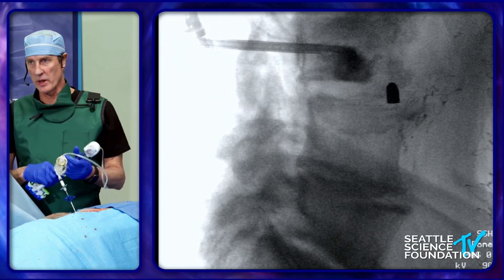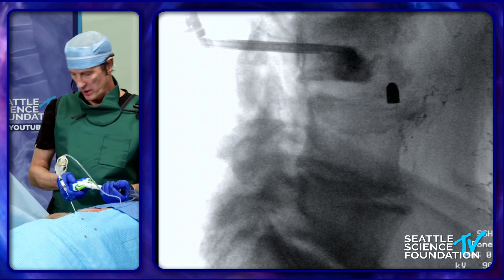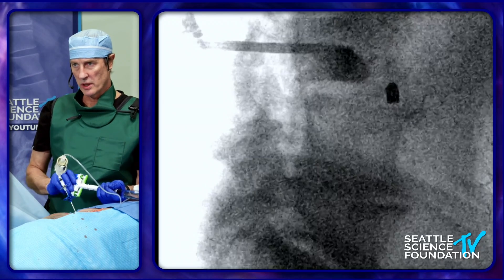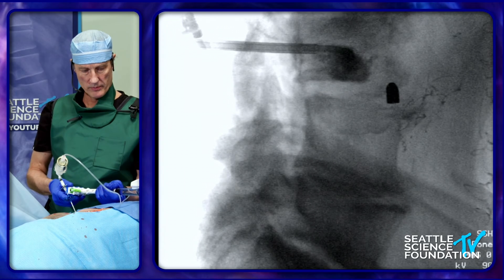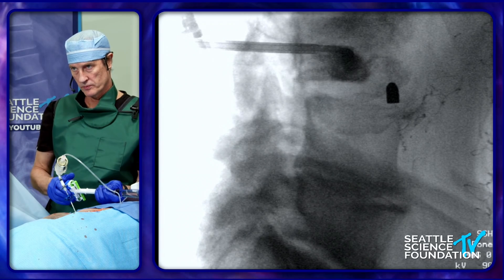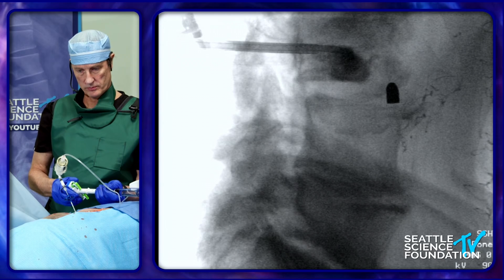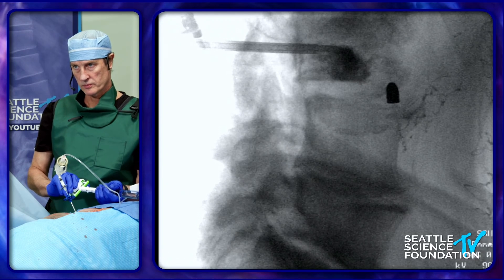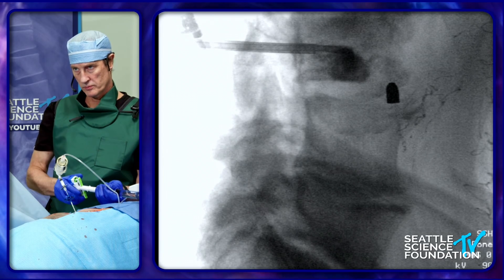So we're going to have a mix of cement with a little bit of contrast. We'll be able to separate the cement from the contrast — as the cement goes in, the contrast will start to come out. And we still have pretty low pressures. Doug, you always mention to the fellows that cement and balloon inflation is done in the lateral view, not the AP view — always in the lateral, so that you can keep an eye on the dural sac and the spinal canal.